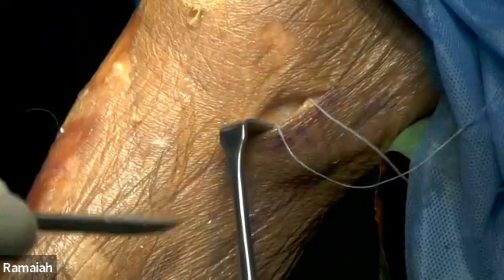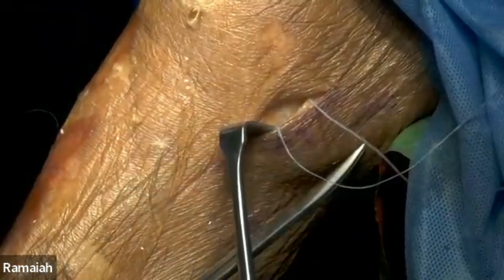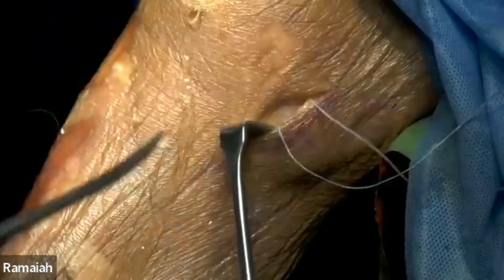If you are able to bring your suture material over this area around the posterior medial capsule, you are almost safe. You don't need to go there at all, but be aware of where the saphenous nerve is. Make a mental note of the saphenous nerve location so you are aware the needle does not go there.